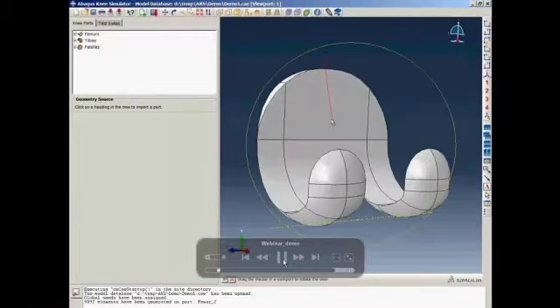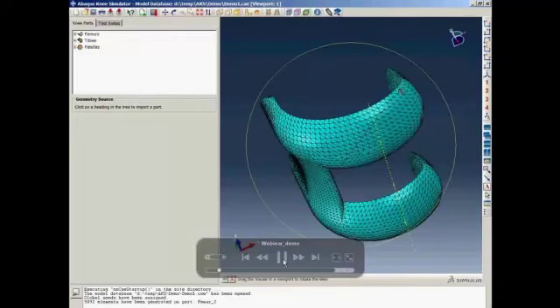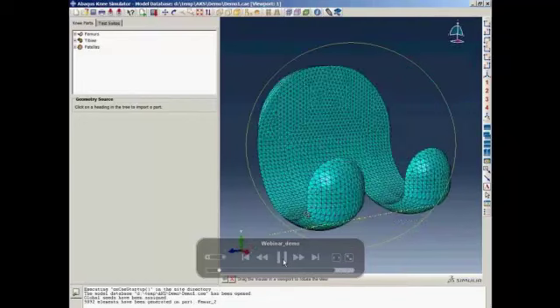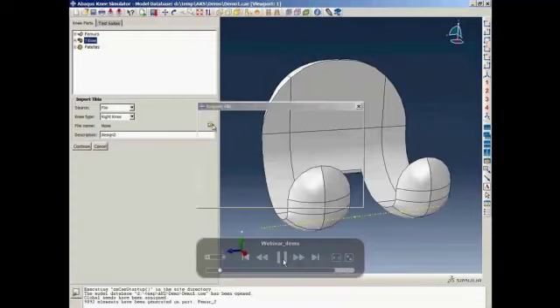So now the femur component has been imported, and you can see the mesh is generated automatically. Next, we import a tibia component.